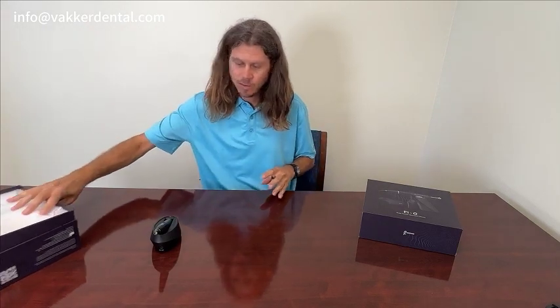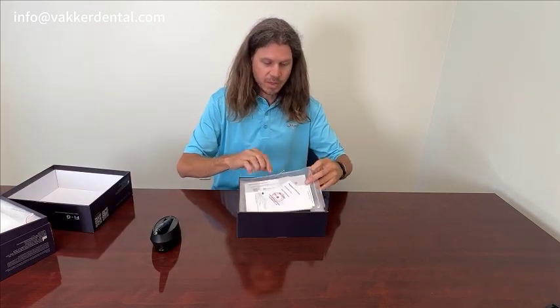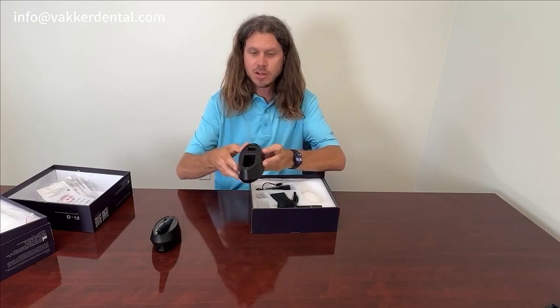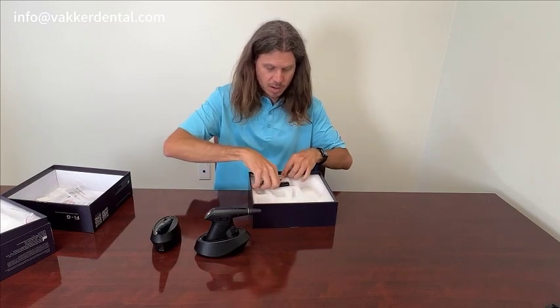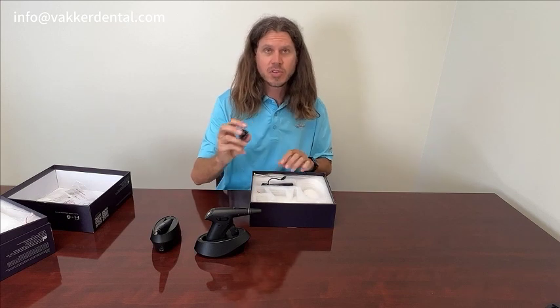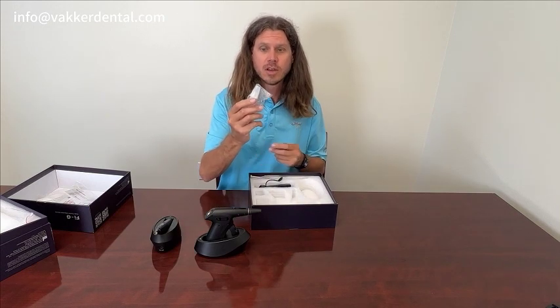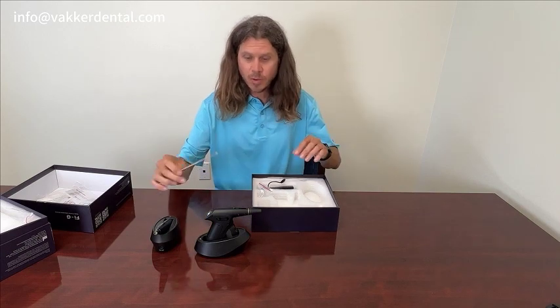Now let's dive into the obturation gun. It comes with the user manual and the warranty card, the charging station, the obturation gun, and the charging cord. It comes with four packs of assorted tips, a tool to bend and securely tighten those tips, four insulation hoods that attach so you're not burning the patient, a ramming rod, and your cleaning tools as well.